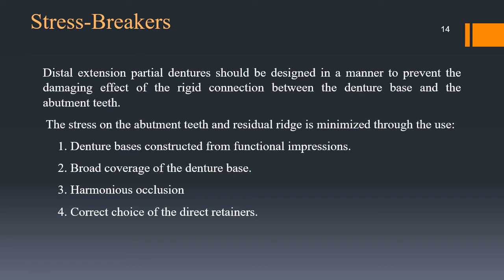Stress breakers. Distal extension partial dentures should be designed in a manner to prevent the damaging effect of the rigid connection between the denture base and the abutment teeth.